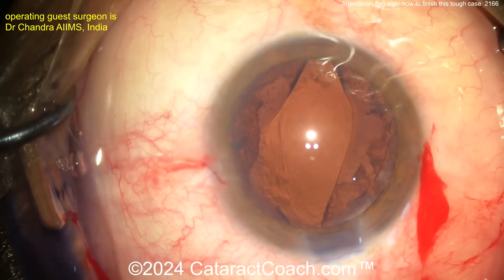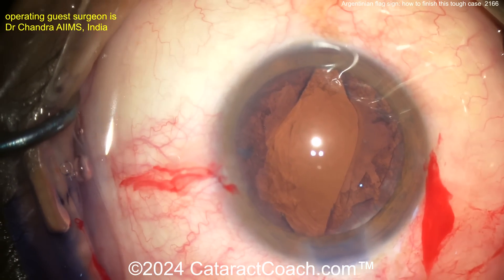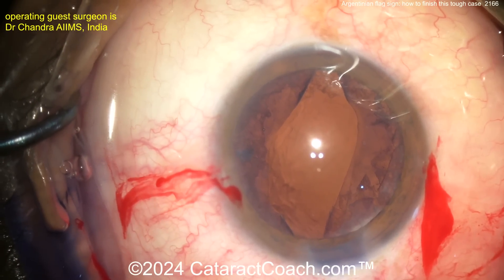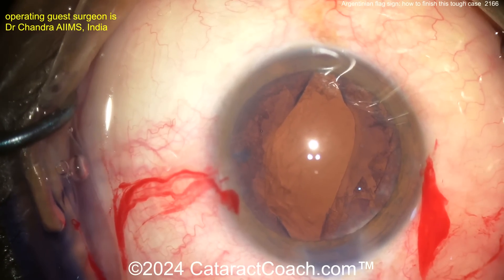Obviously there's no cortex — there's a little viscoelastic. Now let's get the lens in. What kind of lens do you want to put? Well, you can still put a traditional single-piece lens in the bag. I would just orient the haptics 90 degrees away from the area where the capsule has zipped out.